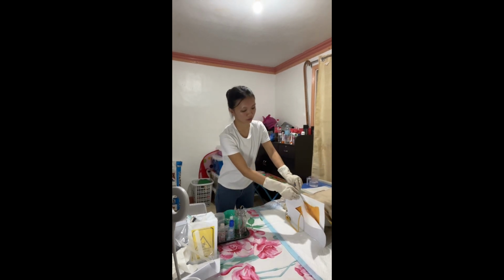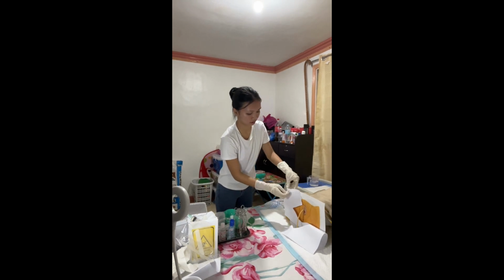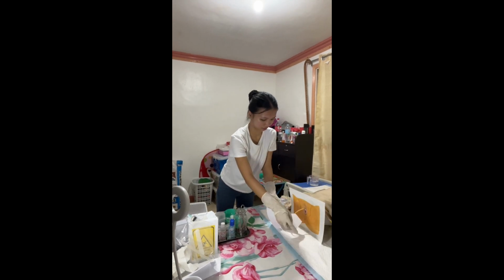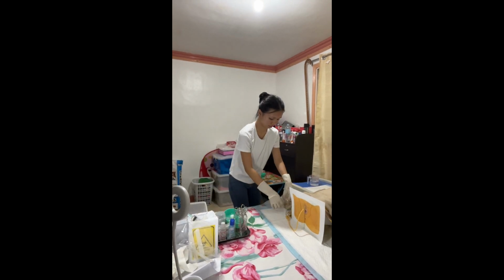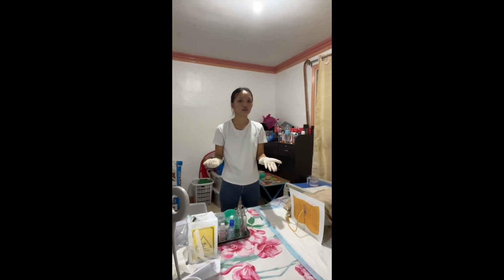So now we are just going to get rid of this eye sheet. And then we have to place the patient comfortably.